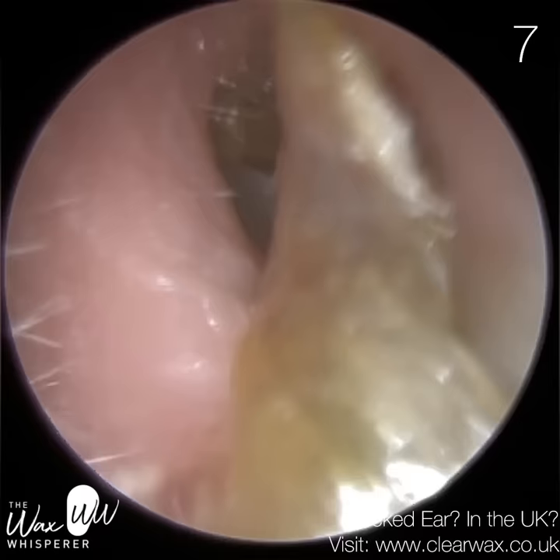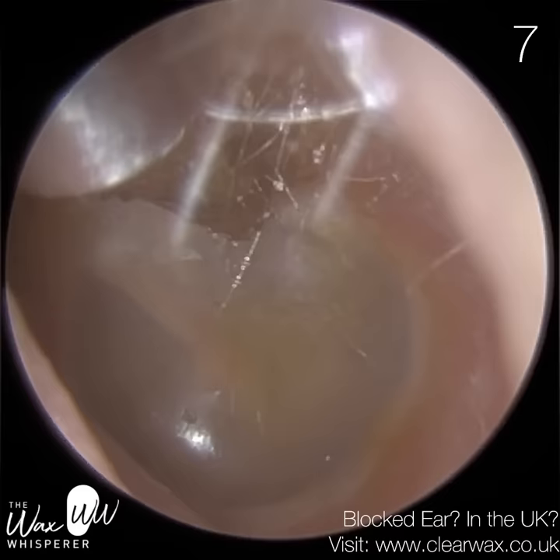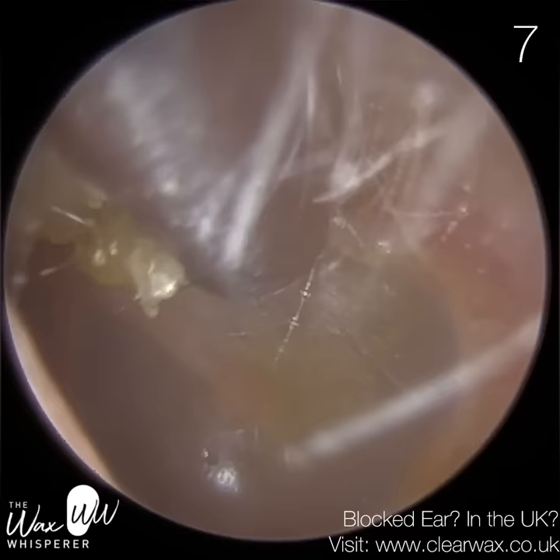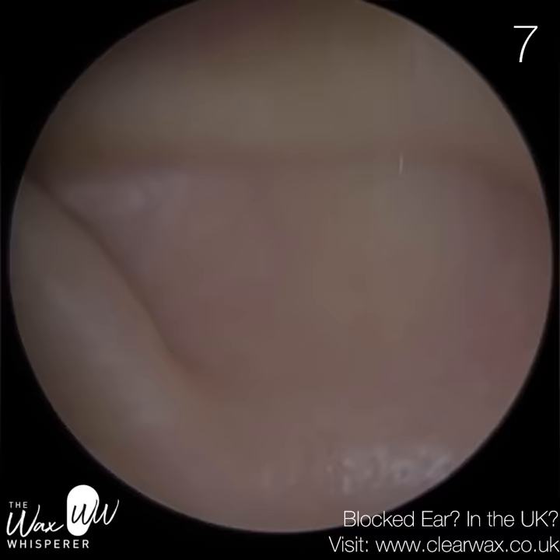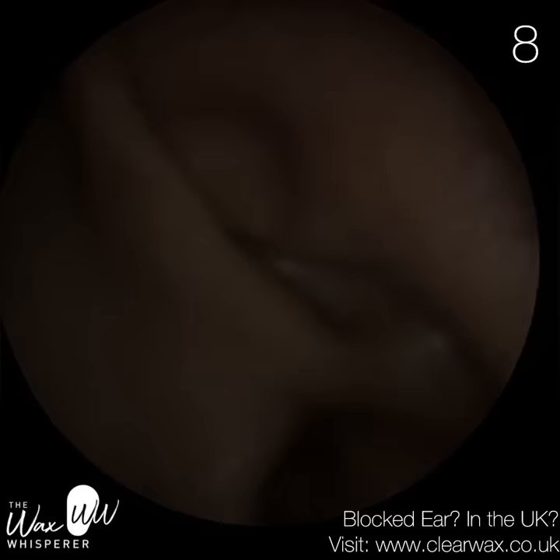We had to stretch the ear open. The plug of wax and skin was quite deep and we just manipulated it out — nice healthy eardrum. I'm going to get this bit of skin and wax crusted at the front of the ear, which I managed to peel away. At the entrance, the patient had a bit of a scab — they'd been scratching the ear. What we removed was causing irritation, so hopefully they'll be fine now.